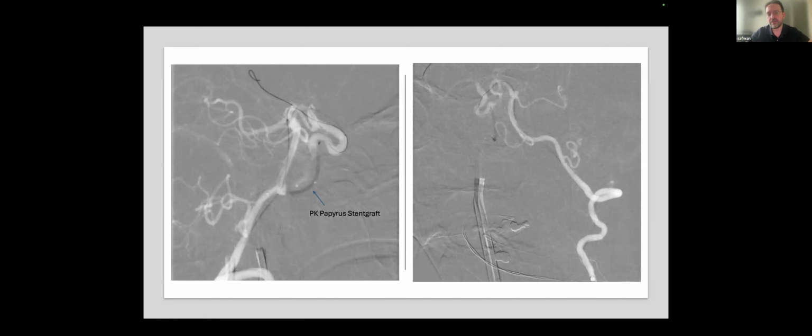It can be pushed a bit higher. The design of the stent is different from BeGraft. It's not that sandwich design. There is the wire of the stent, and it is just between the wires, the mesh of the covered material. So it is more flexible. It can be brought a bit higher than the BeGraft stent in my experience.